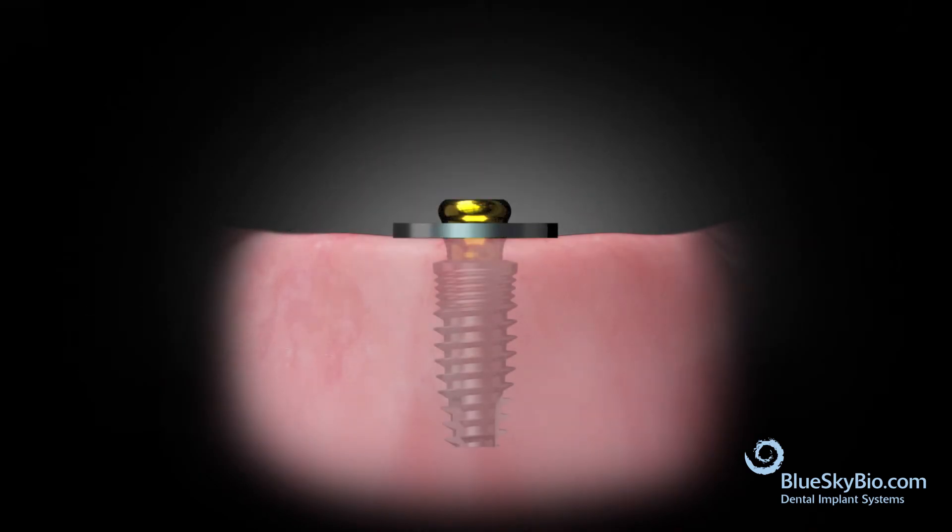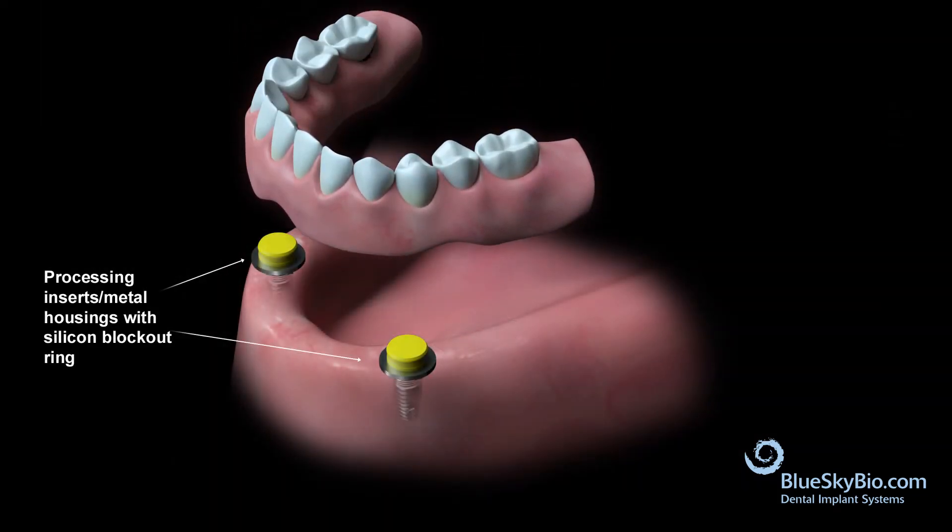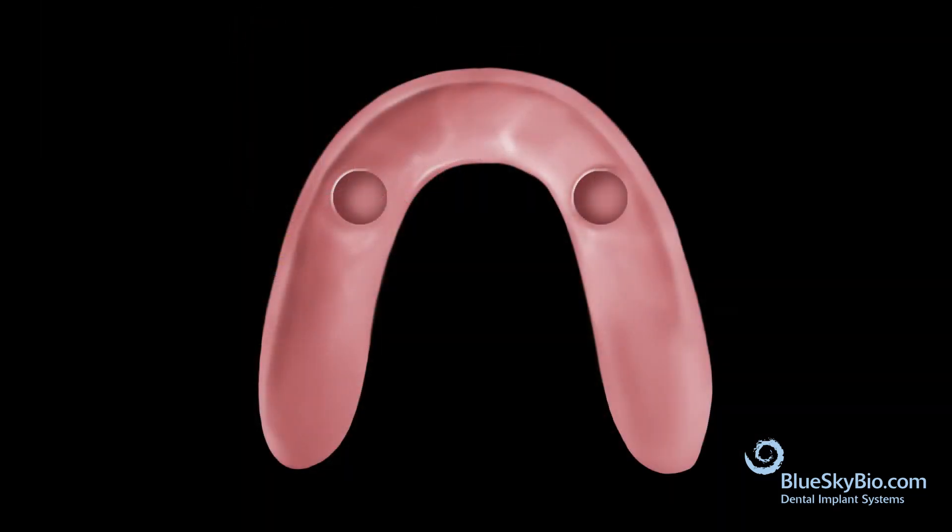Place a block-out ring over the abutment followed by the yellow super snap insert. Remove enough material from the tissue side of the denture to ensure that it doesn't interfere with the housings.